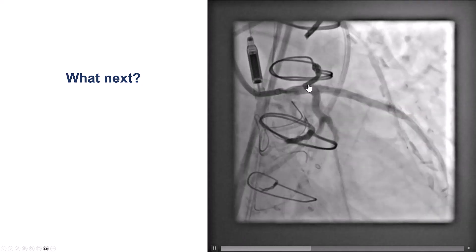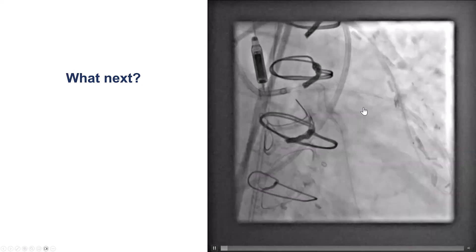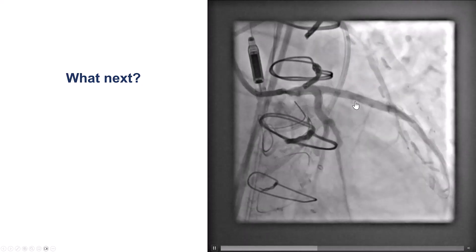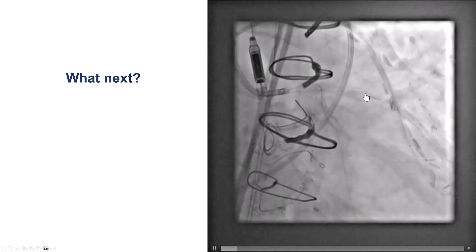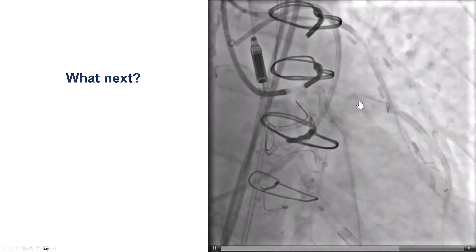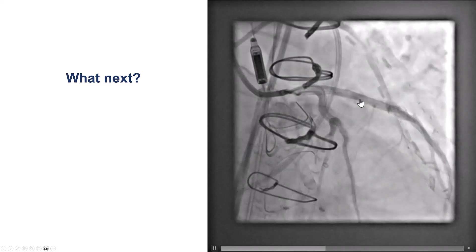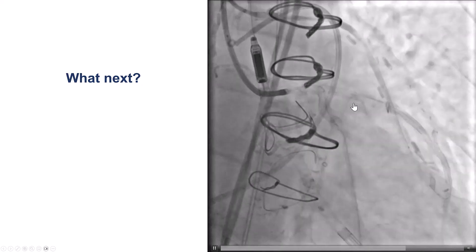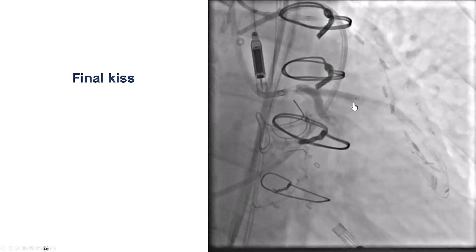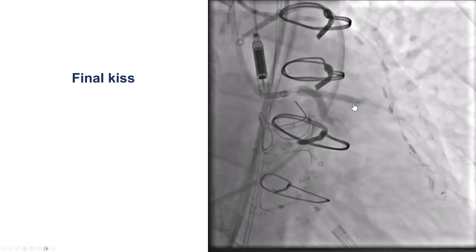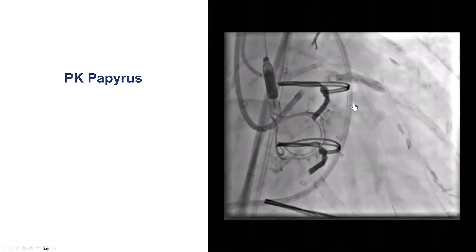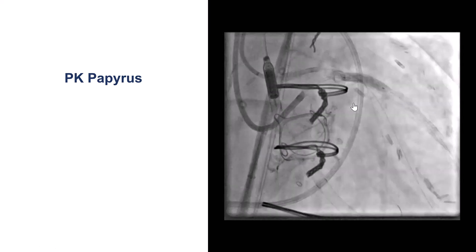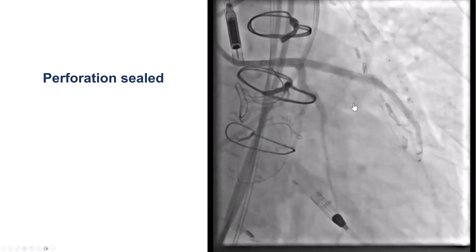After we did that, we saw some contrast extravasation in the LAD. This was probably the area where our initial attempts to cross retrogradely led us to enter — likely a small vessel perforation from the knuckled wire getting into there. We performed the kissing balloon inflation and placed a PK Papyrus covered stent in that area, which provided a nice result.